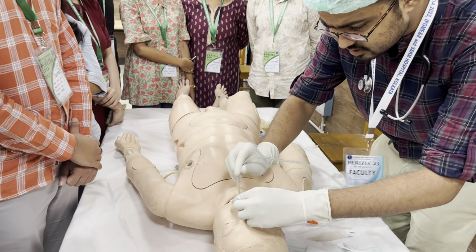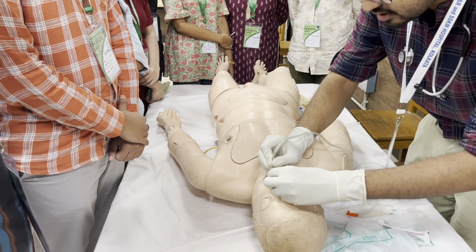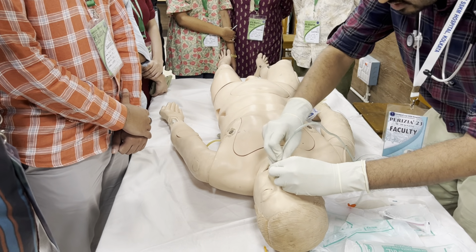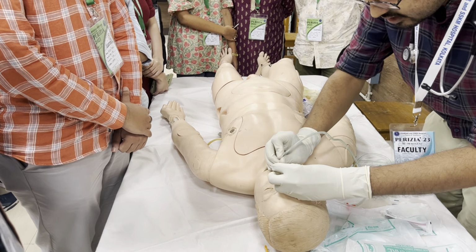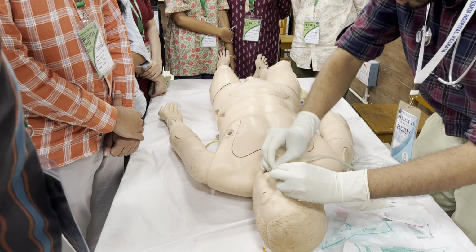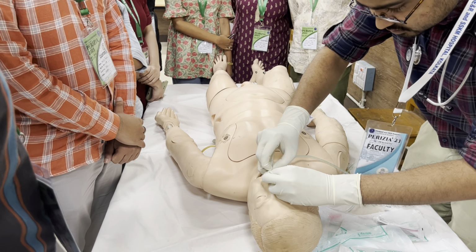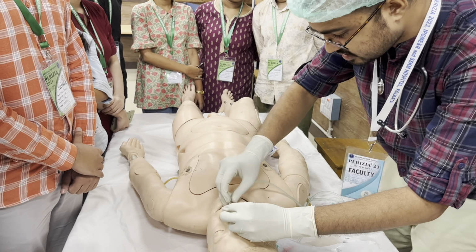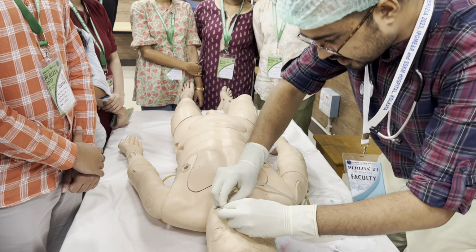Then introduce up to the second mark. Okay, so I'm introducing this tube up to the second mark. I will introduce. Then you have to confirm whether it is properly placed or not. So I am introducing. As you can see, almost the part which has been measured.